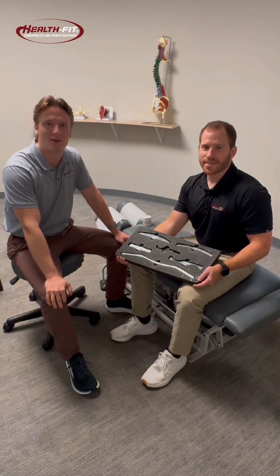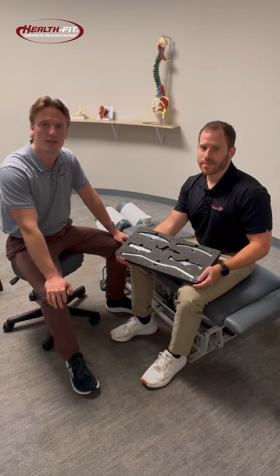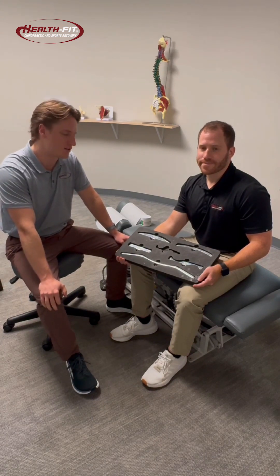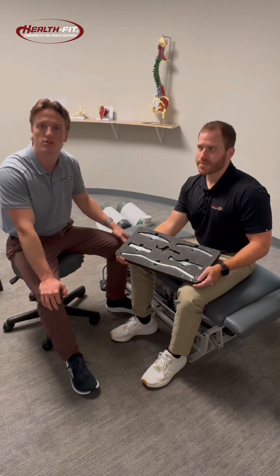Hey guys, Dr. Gage here with HealthFit Chiropractic. Today we're going to go over a treatment modality we use often here in practice for a lot of soft tissue related injuries, and that is instrument assisted soft tissue mobilization, or muscle scraping.